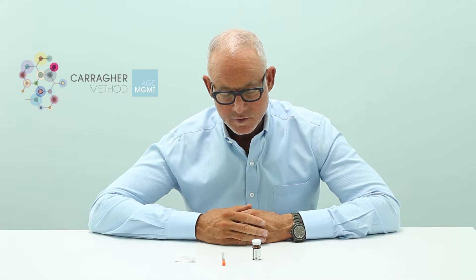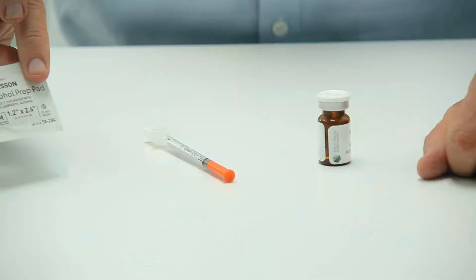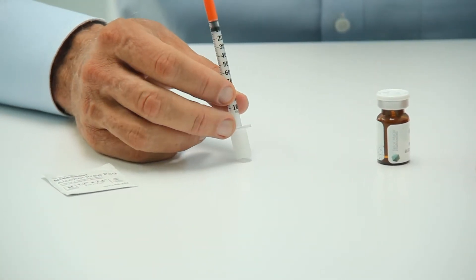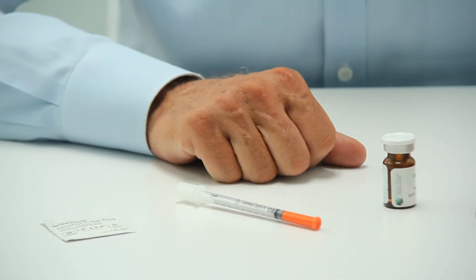As far as doing your injection goes, I've got my supplies here: an alcohol swab to clean the area where we're going to do the injection, the insulin syringe which we're going to draw the medication into and then inject with the same syringe, and then the pre-mixed medication in this vial.